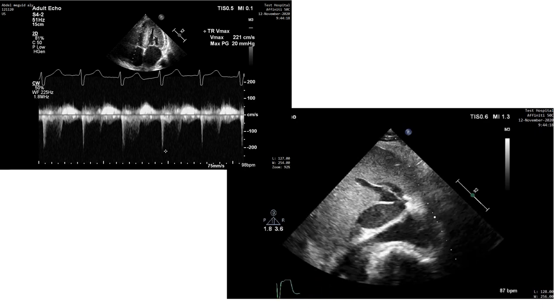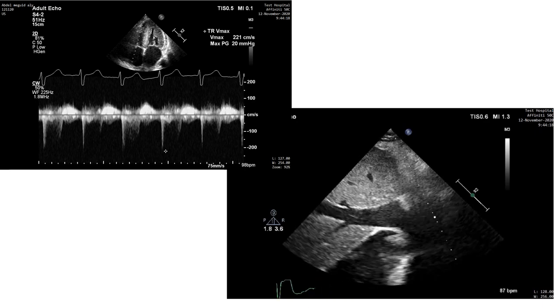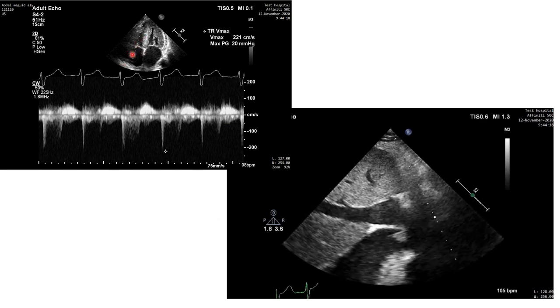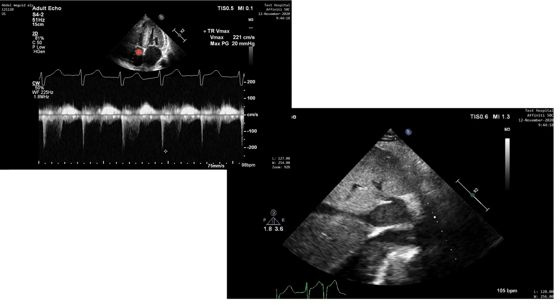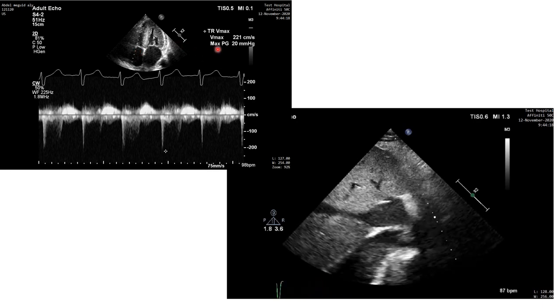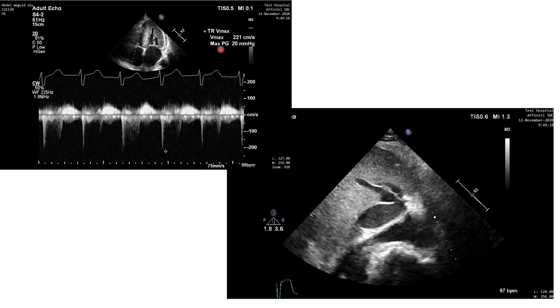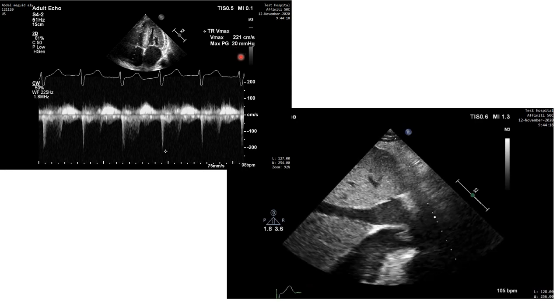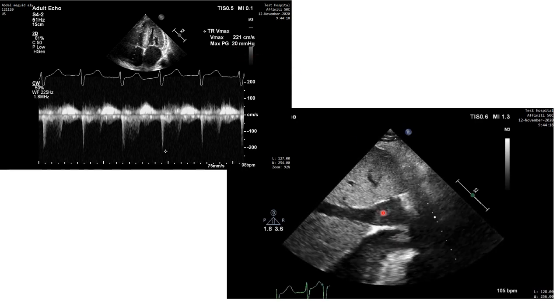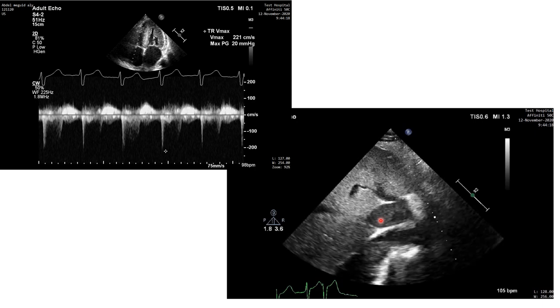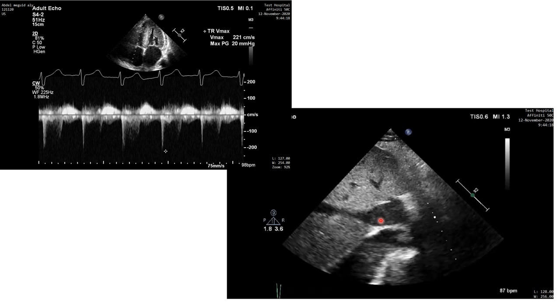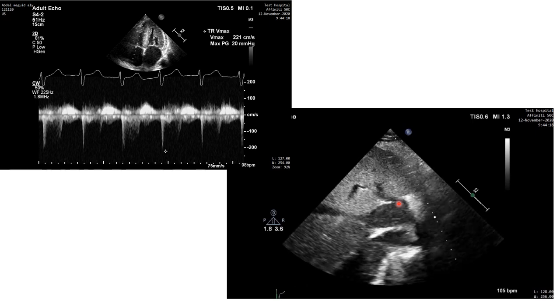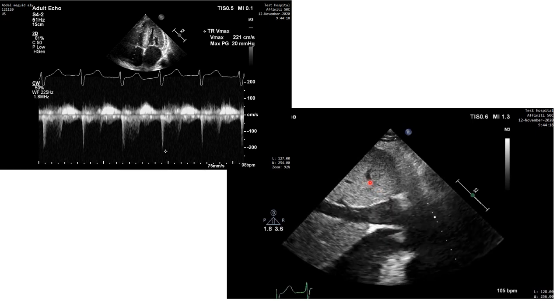This is trying to calculate the right ventricular systolic pressure. In the upper image you can see the cursor with continuous wave across the tricuspid valve, showing tricuspid regurgitation with a maximum velocity of 2.2 m/s and a gradient of 20 mmHg. We will add 15 mmHg because the IVC is dilated and incompressible just proximal to the hepatic vein, which looks a bit engorged.